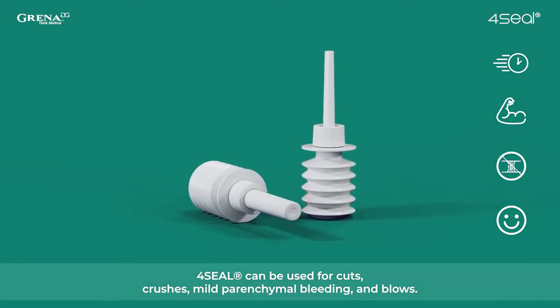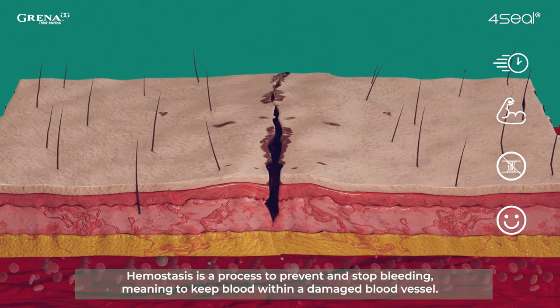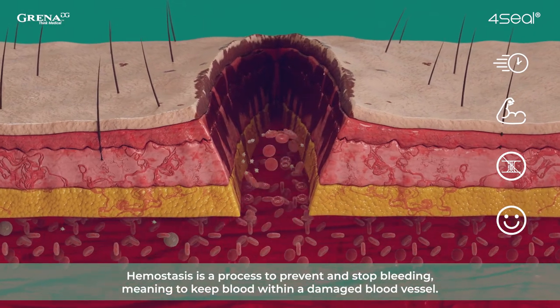4Seal can be used for cuts, crushes, mild parenchymal bleeding, and blows. Hemostasis is a process to prevent and stop bleeding, meaning to keep blood within a damaged blood vessel.